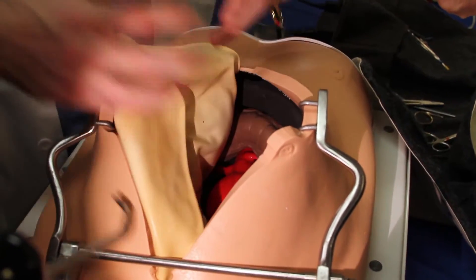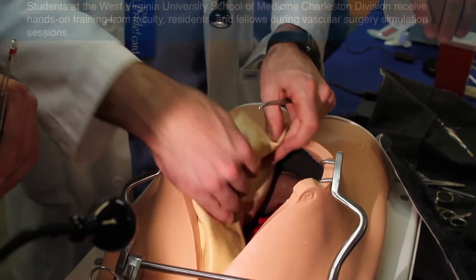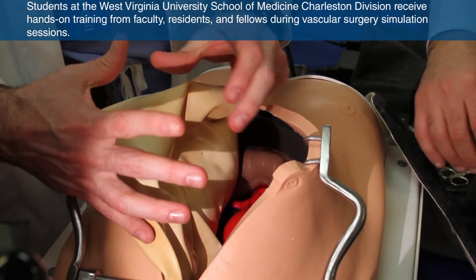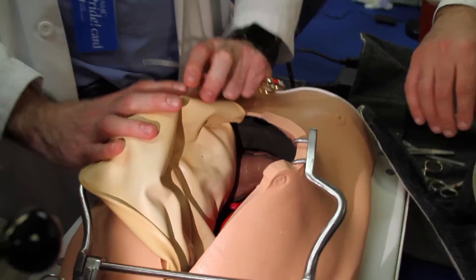Small bowel is eviscerated and brought out to the right side — to the patient's right-hand side. If it's a big belly, you can push it up out of the way. Usually it's easier to just eviscerate it, wrap it in a nice moist towel, bring it on the side, make sure it's not twisted, make sure it's not turning purple, and set it right here on the side.